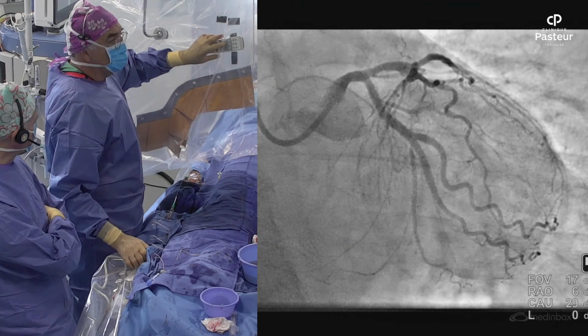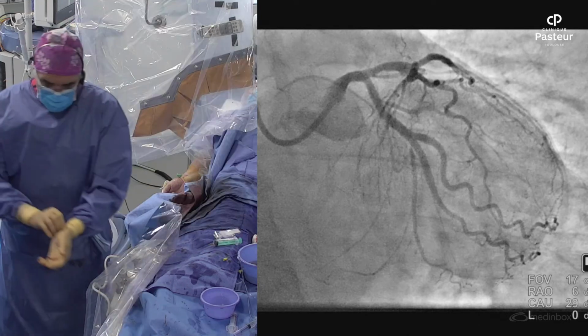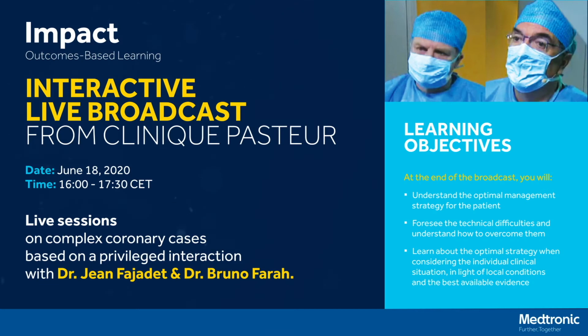So now what we can do is to move to the. We will remove this, and now we join you. If you have any question concerning this case of bifurcation, do not hesitate. You can send us your question, and with Bruno, we will try to answer.